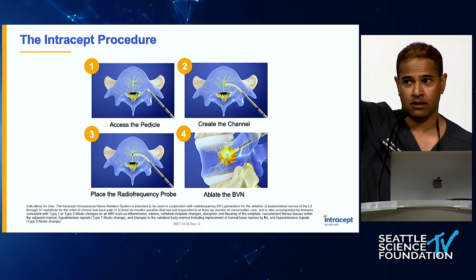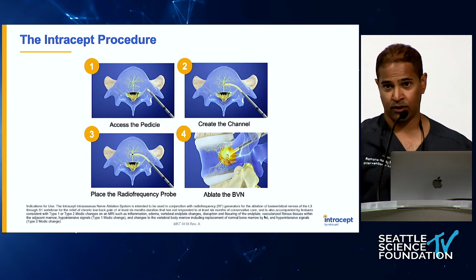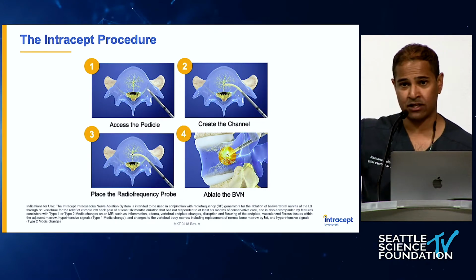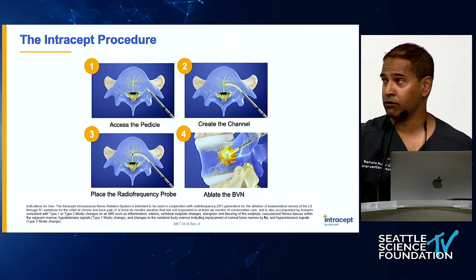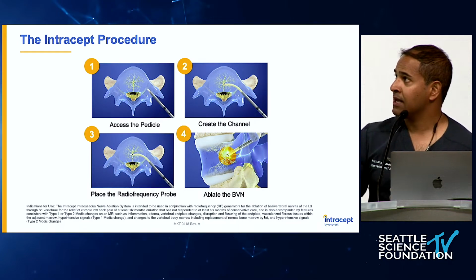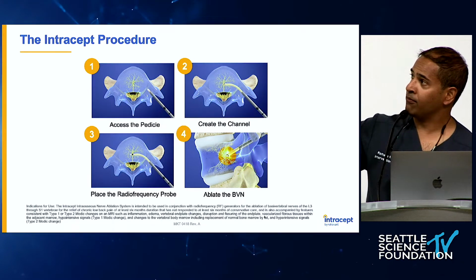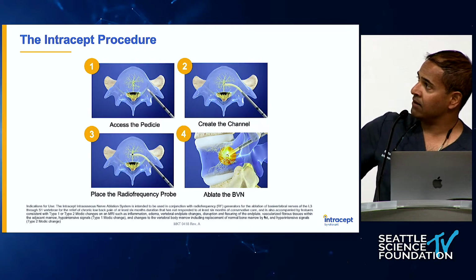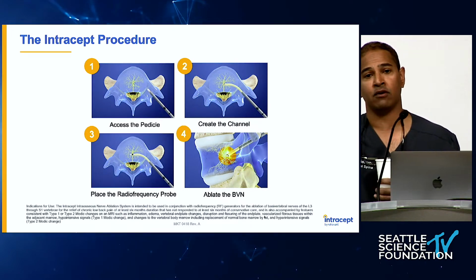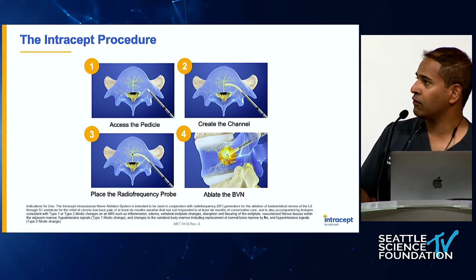How many of you do kyphoplasty? Raise your hand. Great. So there is some slight nuanced difference between kyphoplasty, pedicle access, and this. We're more oblique, right? With kyphoplasty, we want to get to the anterior third of the vertebral body. That's where we're filling our cement. Here, we're trying to get posterior. So we want to be about 30% from posterior to anterior border in the midline. So we might be coming in more at 35 to 45 degrees as opposed to 20 degrees with kyphoplasty, depending on which level we're at.